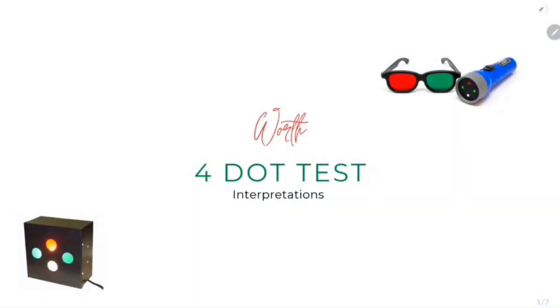Hello everyone. இந்த வீடியோல நம்ம Worth 4 டெஸ்டோட interpretations பத்தி பார்க்க போறோம். So Worth 4 test is a test for BSV and it is a test for diplopia.